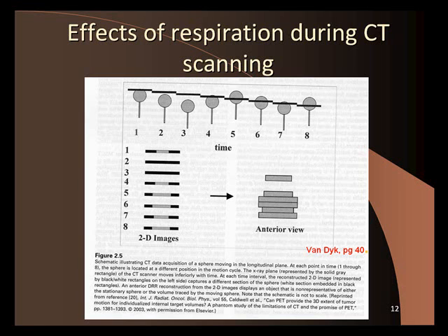Okay, that's terrible. So that's what we've got these days with slow scanners and single slice scanners. This is what we have to work with. So you can see why there's a need to go to 4D to get information about the temporal, or time, information about the tumor. You guys understand how this works? Okay.